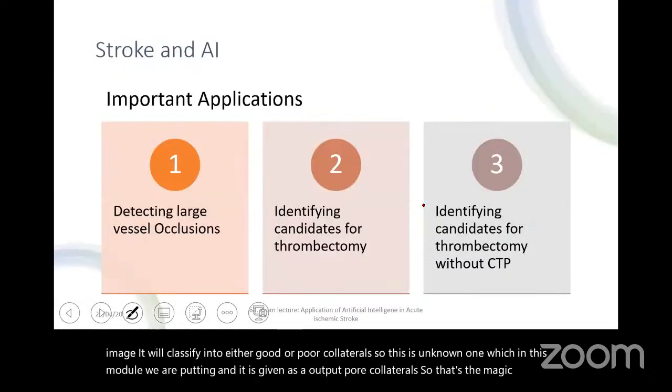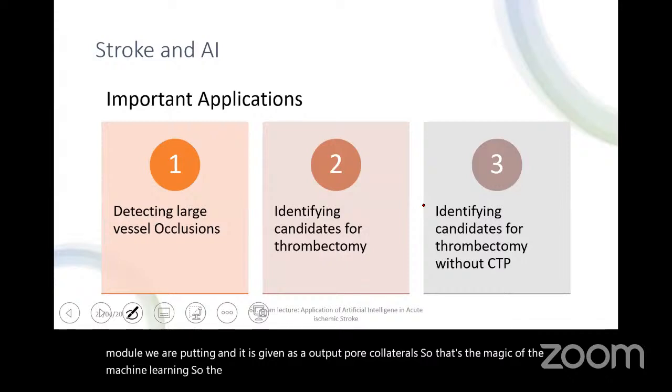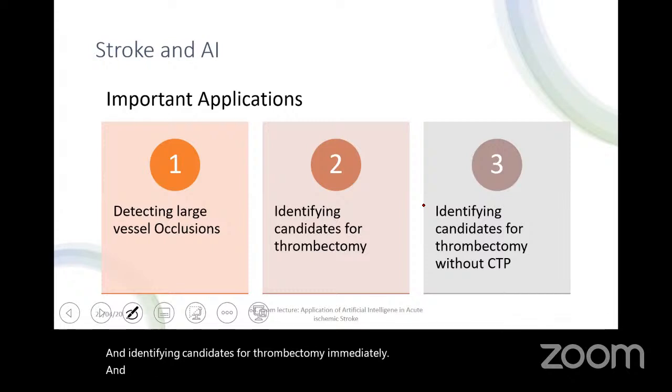The important applications are to detect large vessel occlusions and identify candidates for thrombectomy immediately, and identify candidates for thrombectomy without CT perfusion.